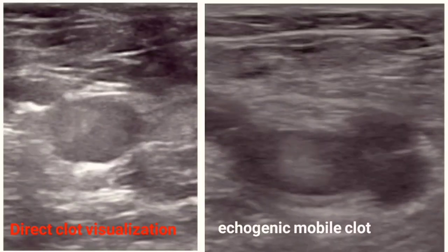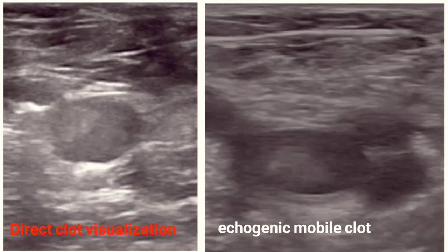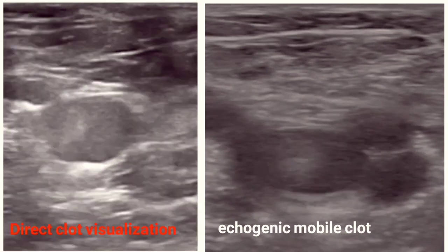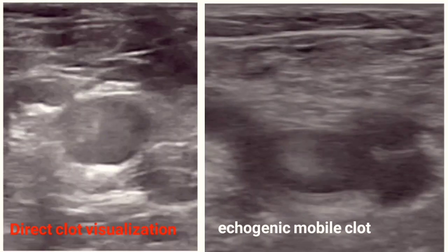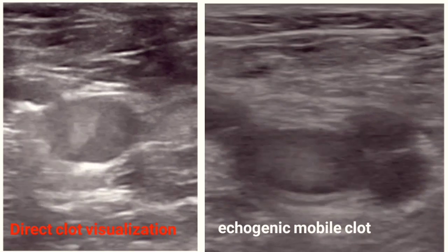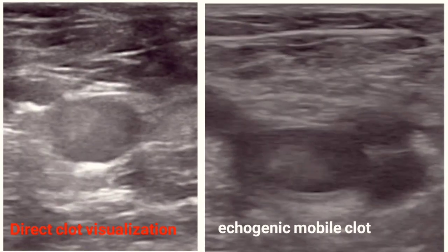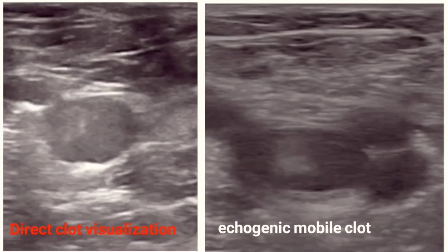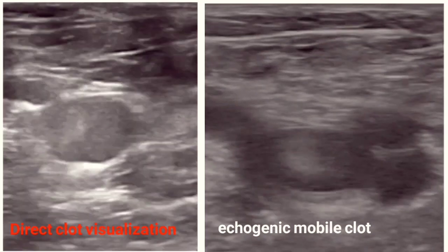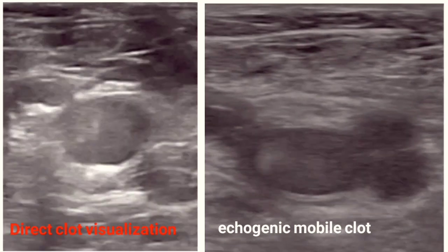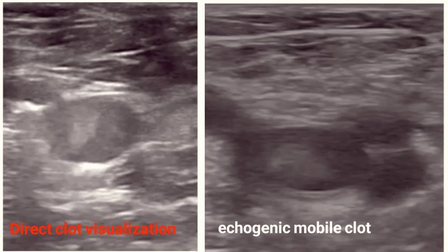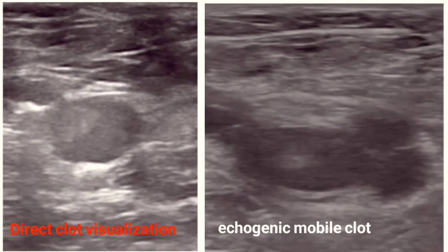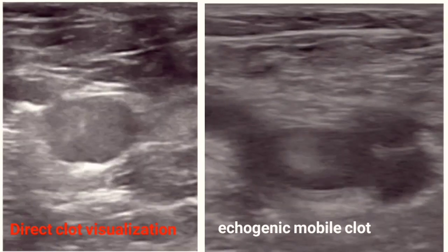Depending on the age of a clot, we may see an echogenic mass inside the vessel. If our probe is directly over the mass, we may not be able to see acute thrombi because they are anechoic or hypoechoic and tend to be near the edges of the lumen. As the thrombus ages, it becomes more echogenic and retracts from the vein walls, making it much easier to detect with ultrasound. When scanning for clots, don't rely solely on direct visualization — always perform the compression technique to avoid missing any acute DVTs.